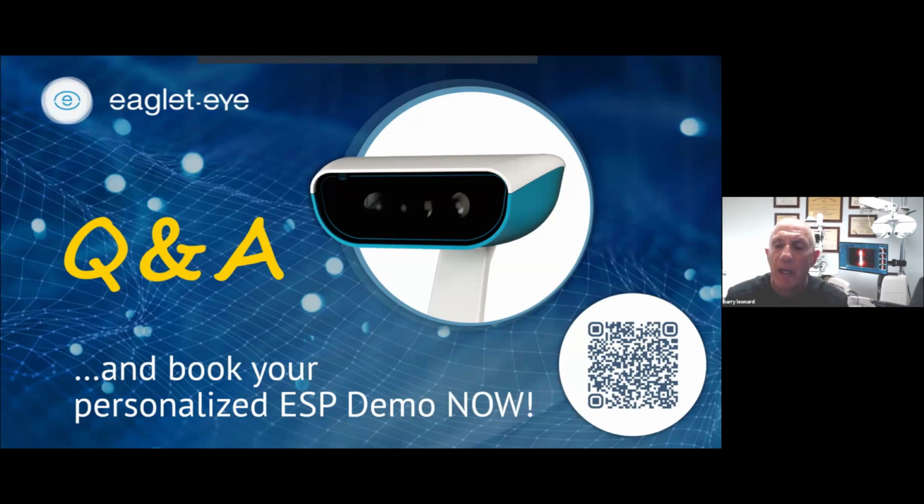But I don't do as many piggybacks anymore, because what I used piggybacks for in the past was going from a reverse geometry RGP and having to use a piggyback. Now I'm going to go more for a scleral at that point. The same with hybrids. I can't adjust enough things for my liking, so I still use them occasionally, but the sclerals I fit probably more than anything else now.